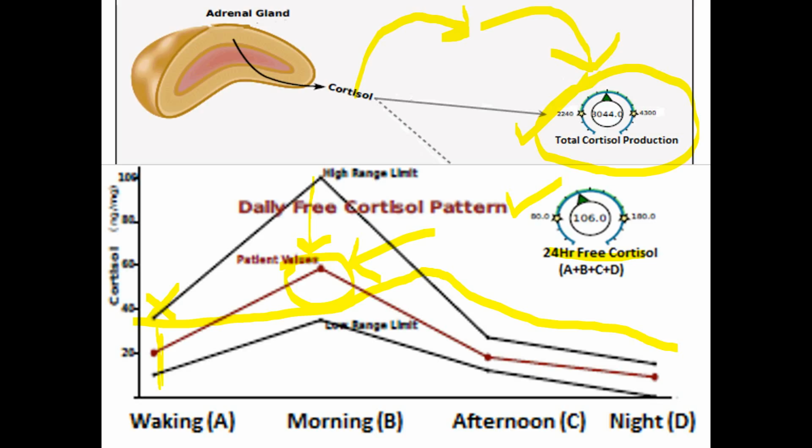And some of it's going to be turned into a metabolite and excreted without getting into circulation as free cortisol. So in that sense, when you're on oral cortisol therapy during the test, that metabolized cortisol number gets, you might say, artificially bloated or increased due to that gut metabolism. So if you're on a quote-unquote normal dose of cortisol, usually those metabolites will be a little bit elevated.